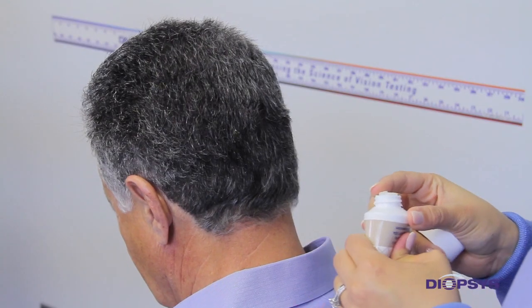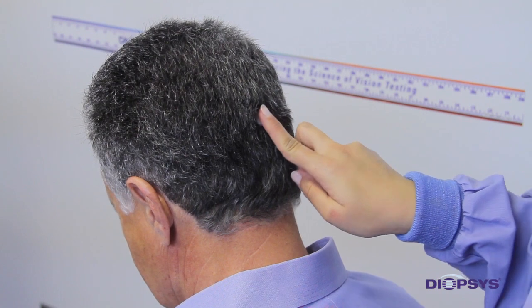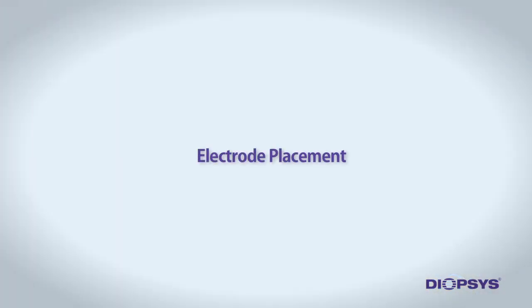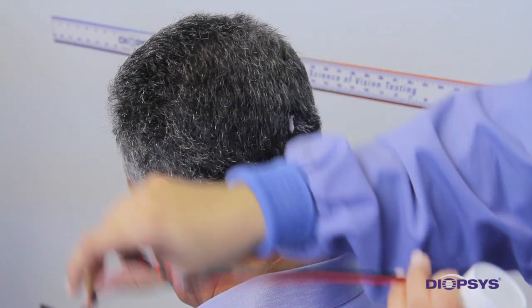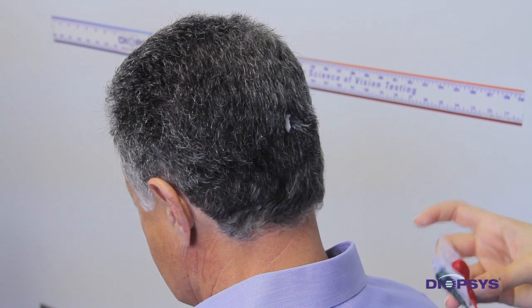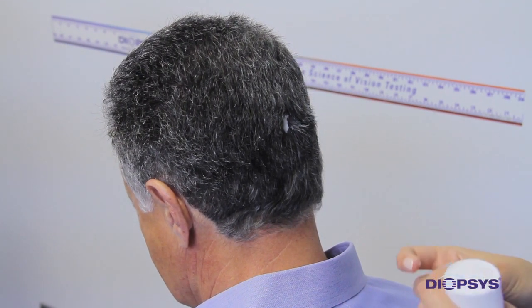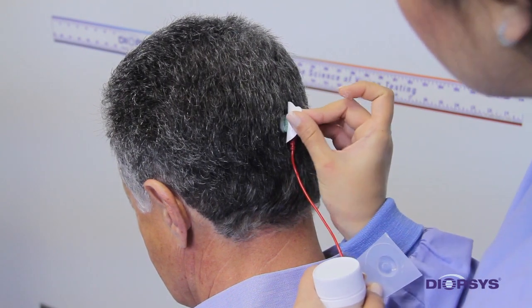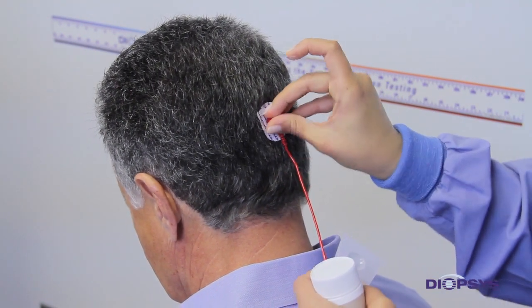Place a pearl-sized amount of 10-20 conductive paste onto the cleansed area on the back of the head. You may choose to apply paste directly to the electrode sponge. The second most important step is electrode placement. Place the center of the electrode connected to the red lead wire directly over the conductive paste on the back of the patient's head, covering the conductive paste with enough pressure to ensure good adhesion.